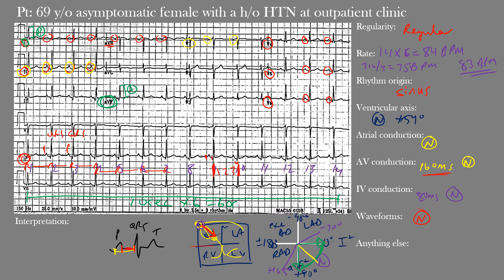Is there anything else we're missing? Let's look at R-wave progression in the precordial leads. Normally, R-wave amplitude should progressively increase from leads V1 through V5. Looking at the precordial leads V1 through V6, we can see the R-wave amplitude increasing — it's smaller in V1 and slowly increasing through V5. The R wave is the first positive deflection of the QRS complex after the P wave. We would call this normal R-wave progression.